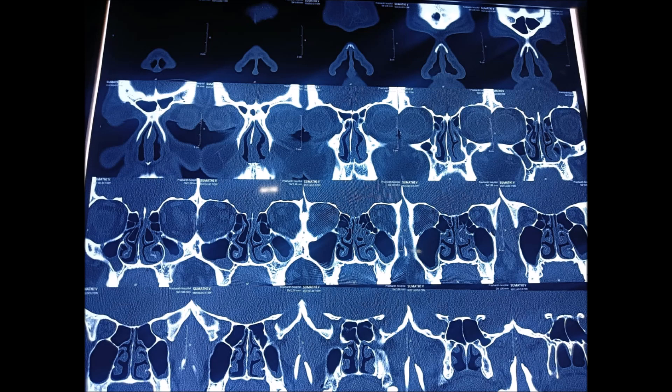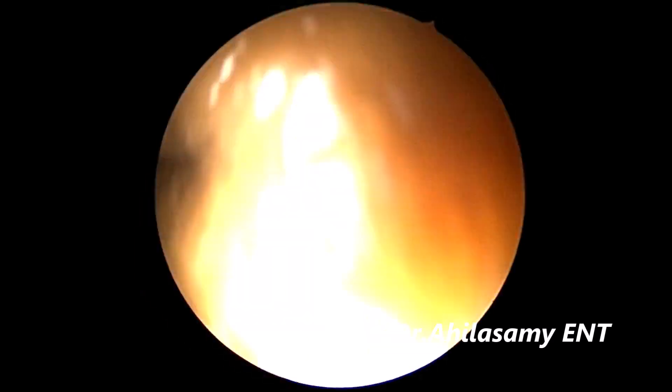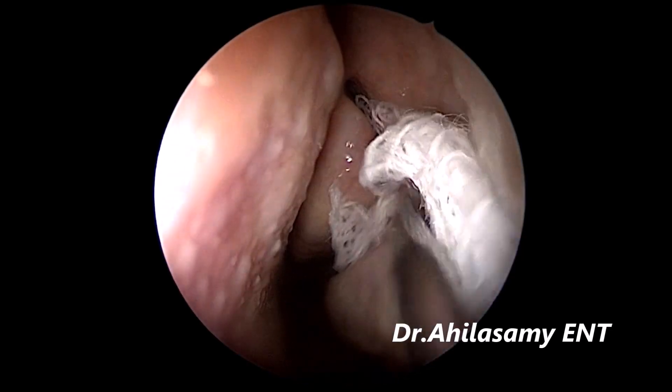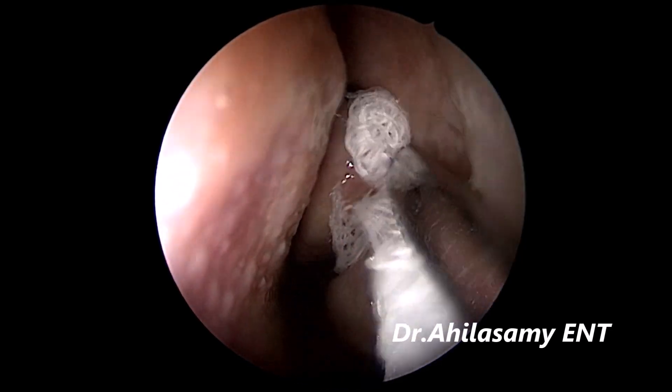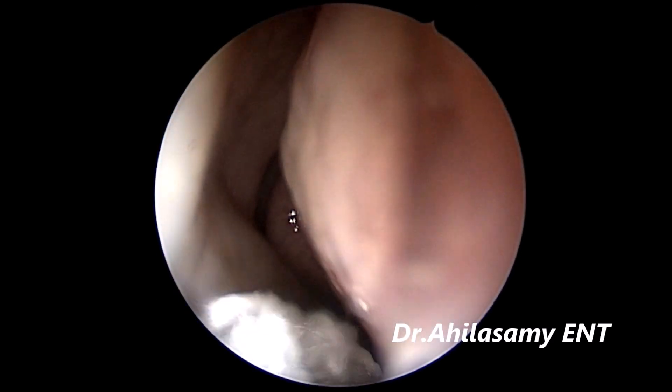Then you can appreciate these videos very well. I am taking this case under local anesthesia. She is a 39-year-old female patient with good moderate IV sedation. First step is packing the nasal cavity with a 4% lignocaine and adrenaline solution in the ratio of 1 to 1.